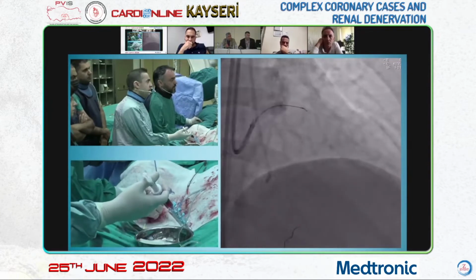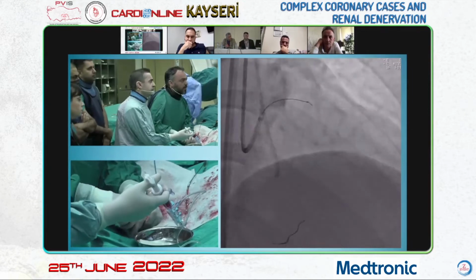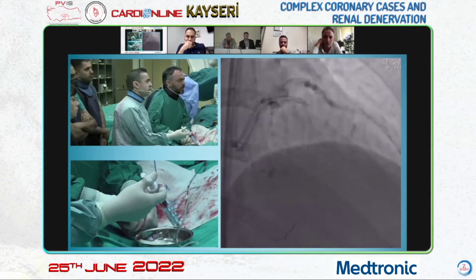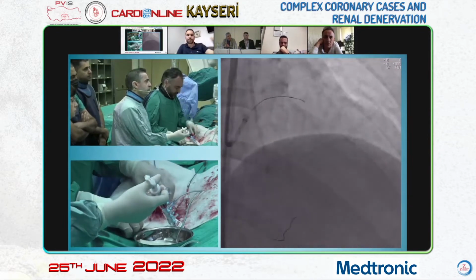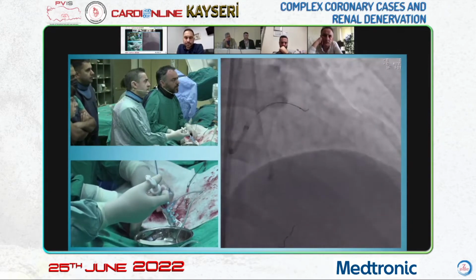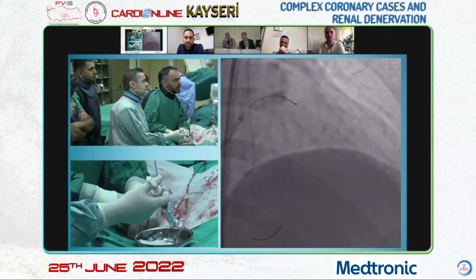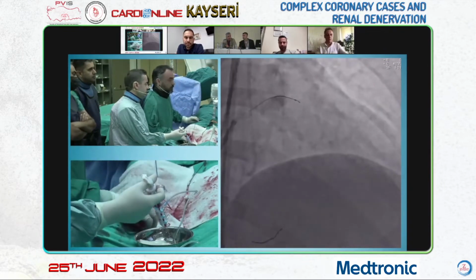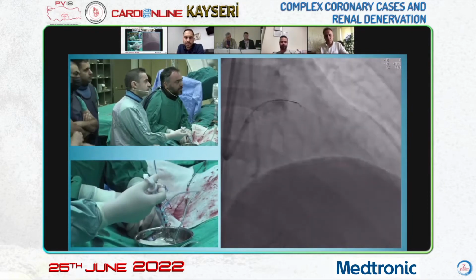I'm not giving some opacification. The vessel may not be the LAD. What do you think? From different angles, we need to verify it. The CTO segment is a long one. In the first section, there is a connection with the channel. The LAD was verified with the first images. When there is a connection, we shared it with the colleagues in the panel.